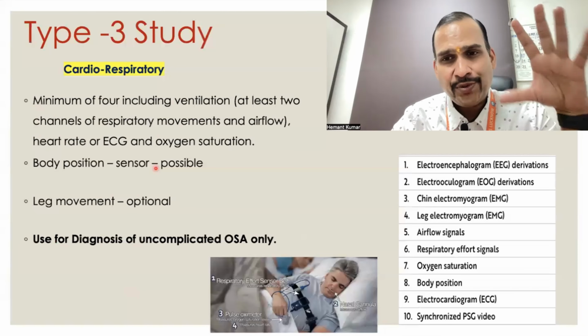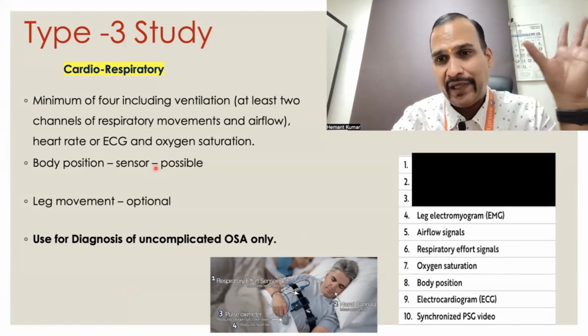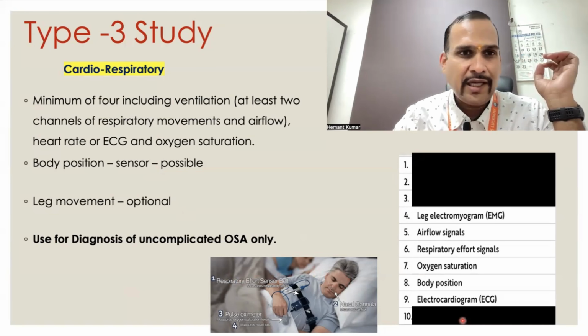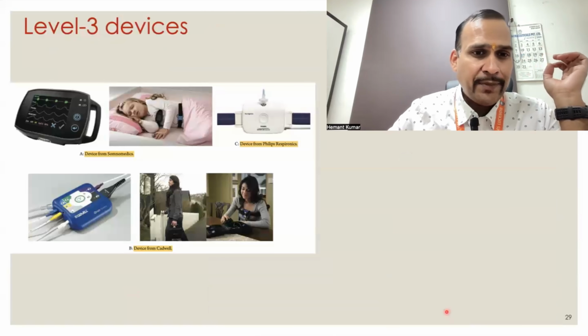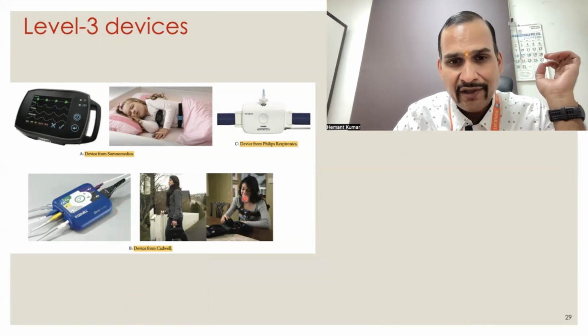Okay, so there is no EEG, no EOG, no EMG because there are no sleep parameters, and there is no video recording. This is type 3, the type 3 devices, the small devices. Since these are small devices, the patient is very comfortable while doing these sleep studies.